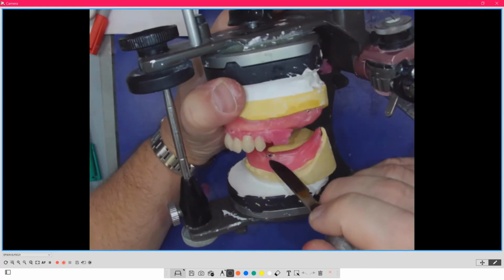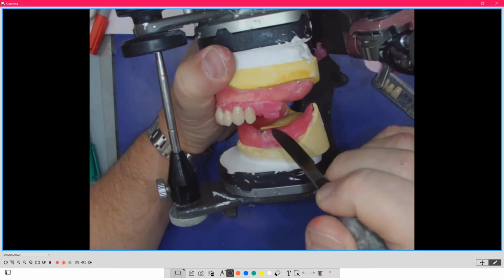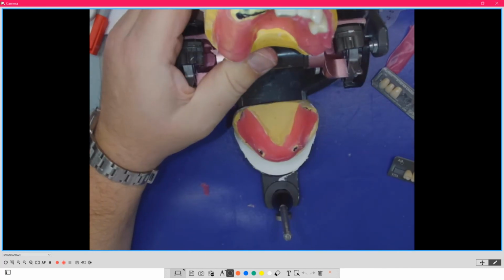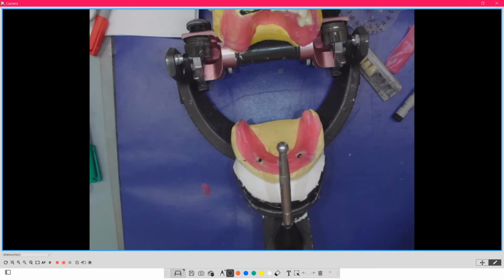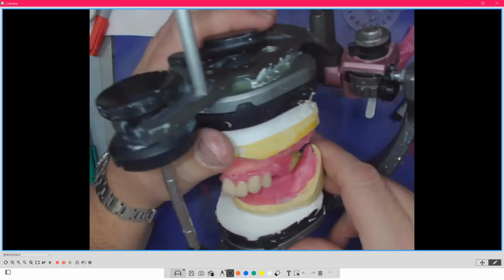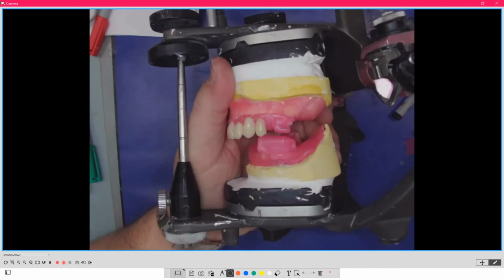So I'm knowing that with this setup I'm a little bit anterior to that position, given that this is a class 2, but it's an exaggerated class 2 for the demo today, because I wanted to make things a little bit more aggressive so that you can see it on the screen better, versus in a live course where we can have a little bit less. It's just what I've learned doing webinars: you have to over exaggerate a little bit so people can see the fine point.